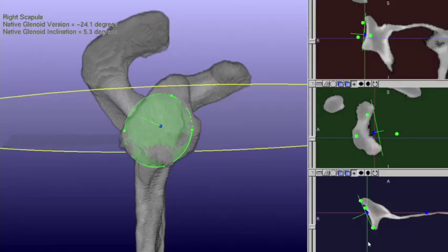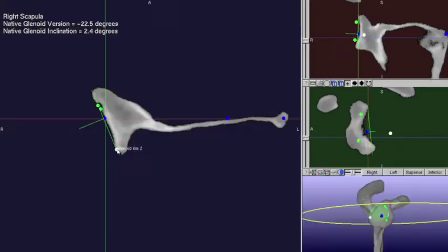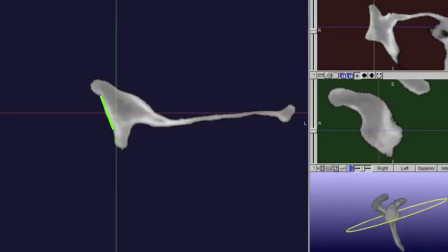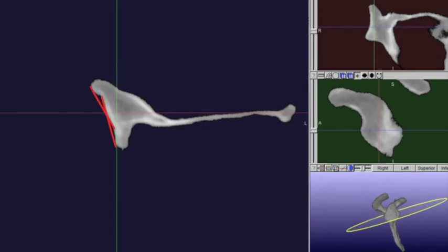We next need to define the plane of the glenoid itself. These three points must be placed on the true glenoid rather than the osteophytes, as this will obscure true interpretation of anatomy. The green line represents the true version of the glenoid — referencing an anterior osteophyte increases the apparent retroversion, while referencing a posterior osteophyte decreases it. Comparing these lines shows the wide variation possible when interpreting version for a specific patient, which is why you need to understand how your software automates the version calculation.